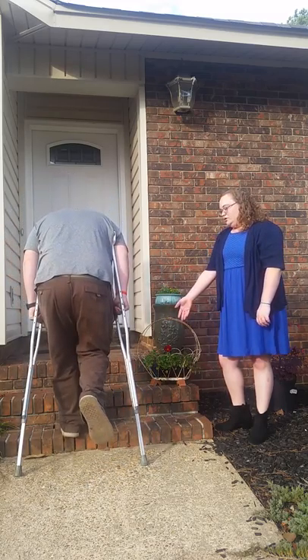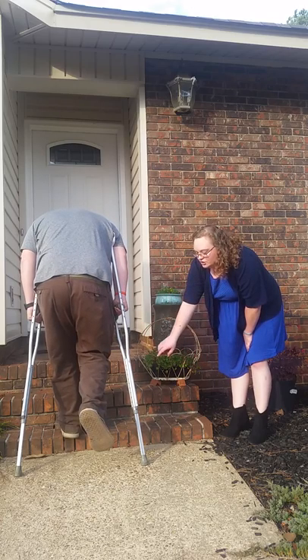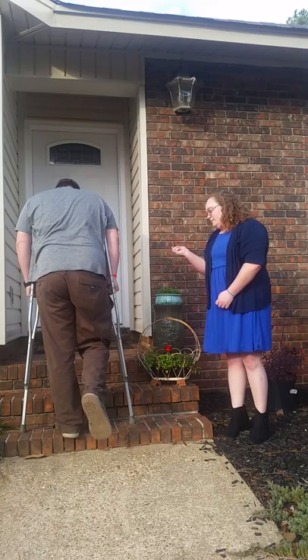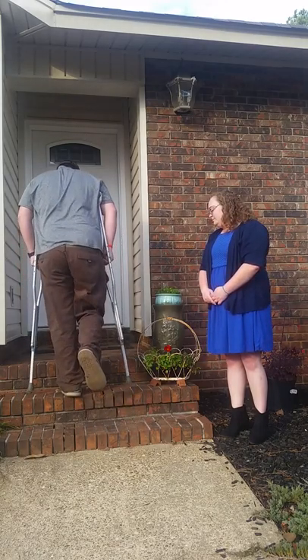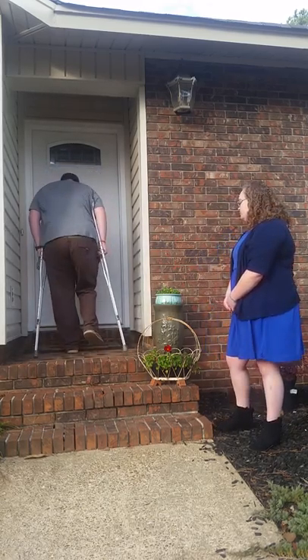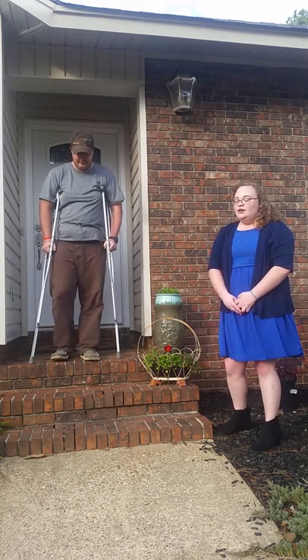Going up steps: you're going to take your uninjured foot and hop up onto the step — the crutches are going to support you. Then take your crutches and your injured foot and bring them up to that same step. Repeat.